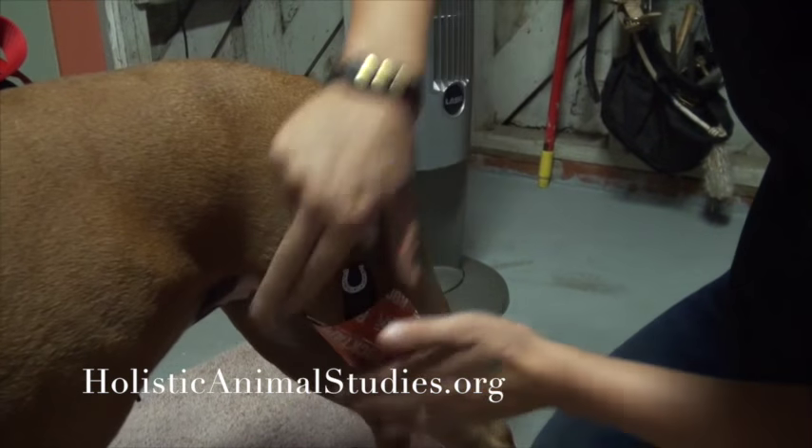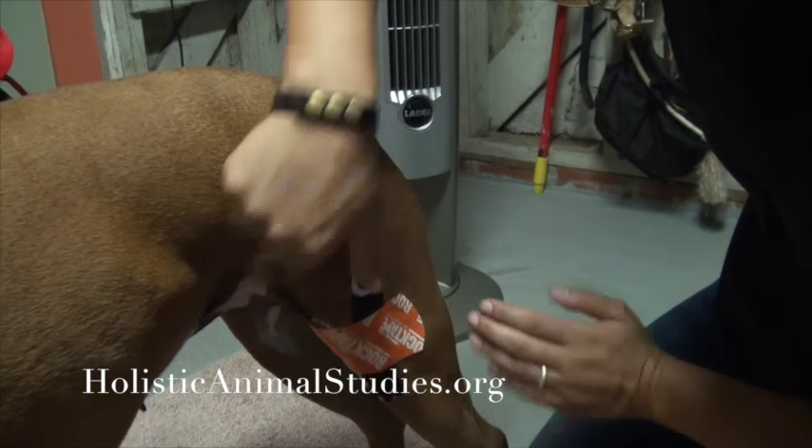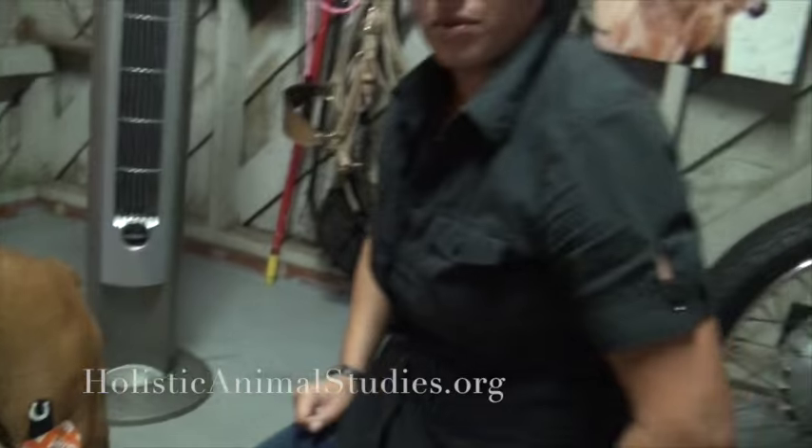We're just going to rub it down to try to activate the glue a little bit better, and that is what the knee support would look like.